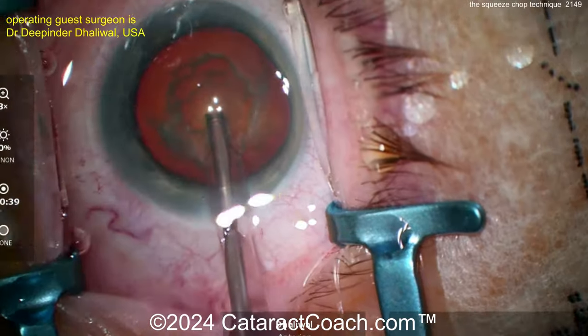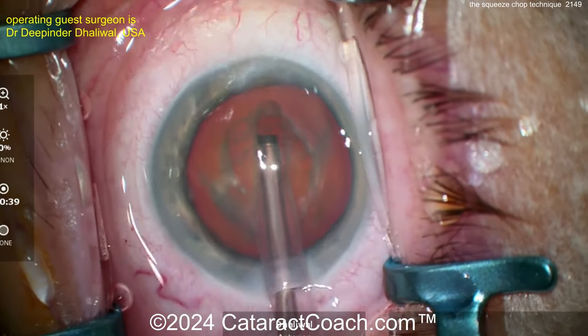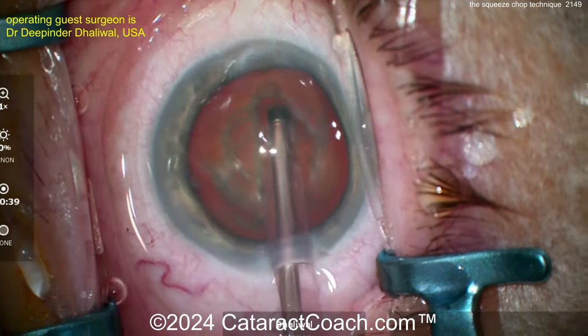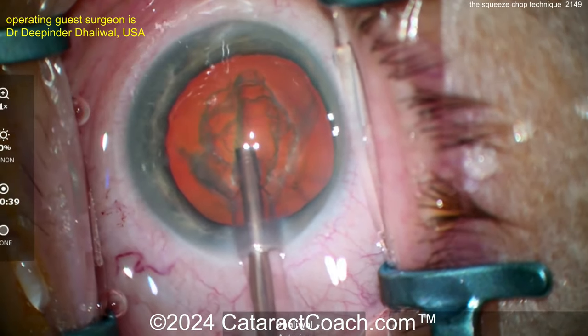Brilliant idea. Here comes the groove in the stop-and-chop, making a groove right down the middle. You can see it — shallow in the periphery, deeper in the center, as it should be. Beautiful. Then the nucleus will be split in half, and once that's done the pieces can be chopped. There's the groove down the middle.